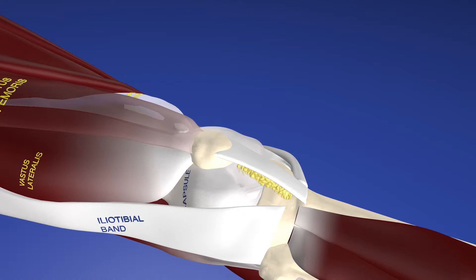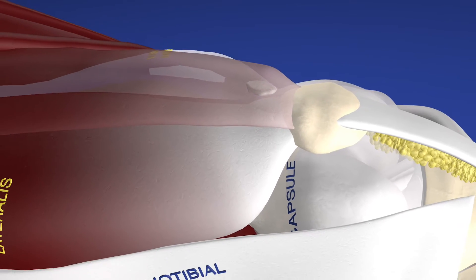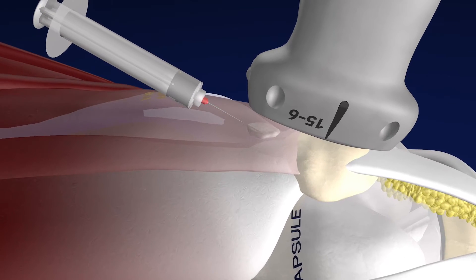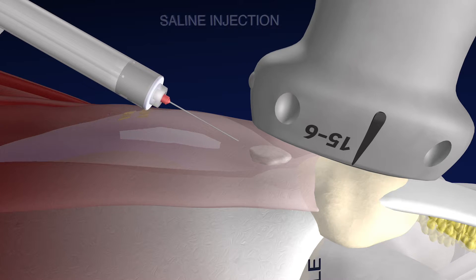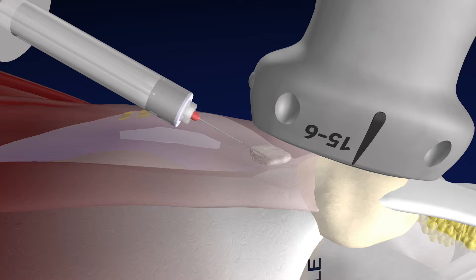Let's look at this in a little more detail, seeing the pertinent anatomy. Here essentially is the calcification within the rectus femoris tendon, which is somewhat translucent. We're initially injecting some lidocaine just superficial to it, and now we're beginning the needle tenotomy trying to break up some of that calcification within the distal tendon. Here we're zooming in on that calcific body and now injecting some saline into and around this calcific spot.